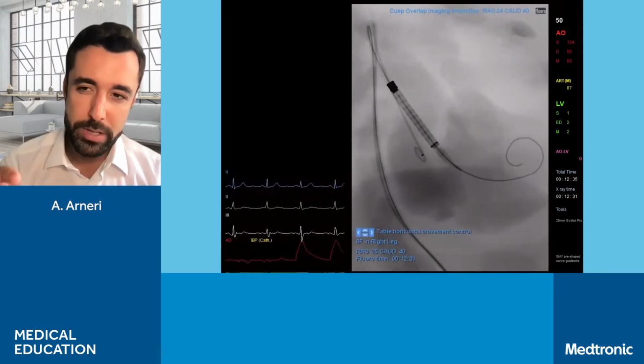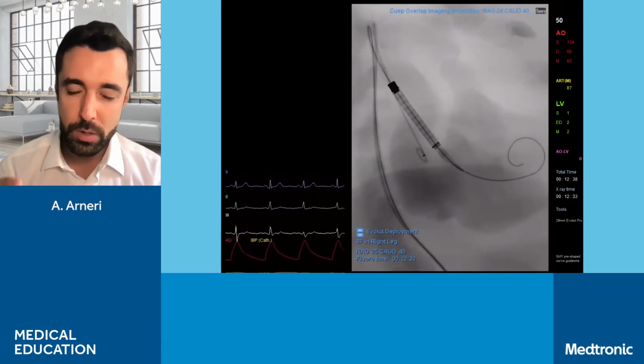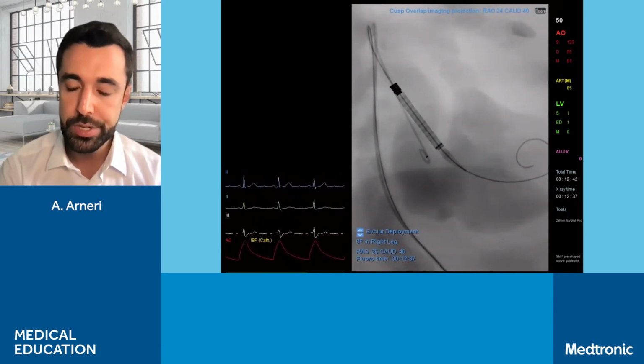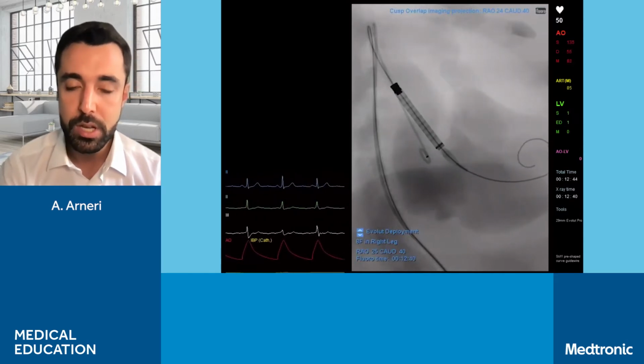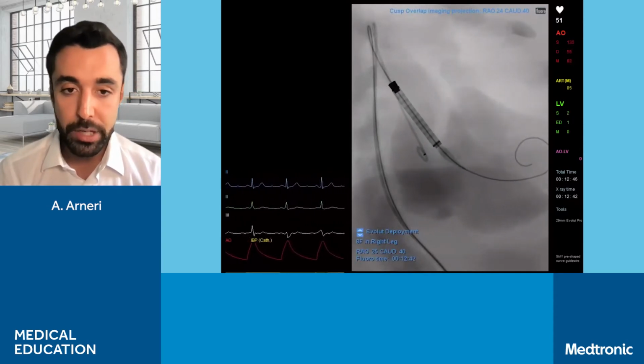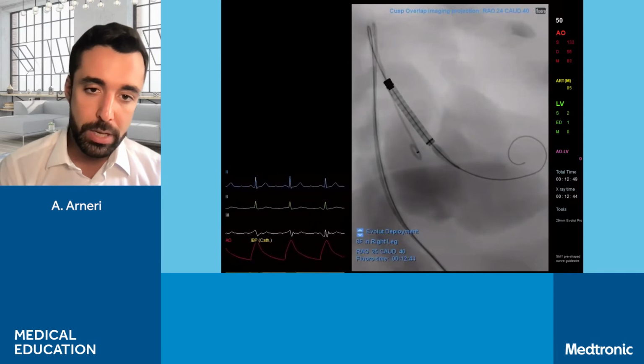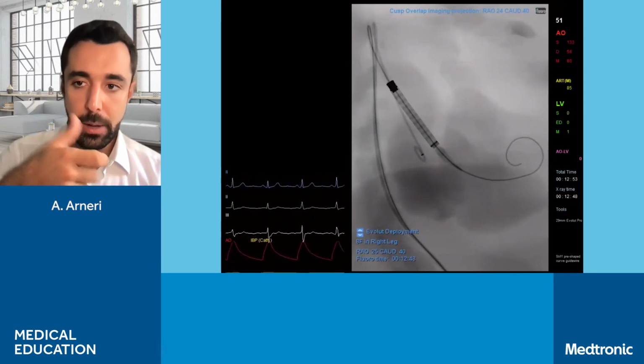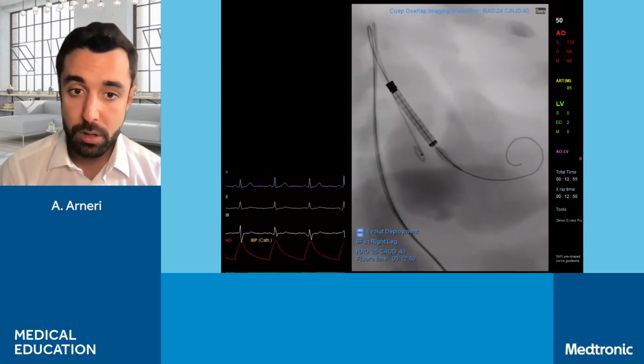So now you see we are starting above the annulus, not into the ventricle, which reduces the scratch of the nose cone of the capsule over the conduction system. This technique really reduces the risk of pacemaker implantation. And we can start now really slow to release our valve. So we start rotating the handle of our delivery system really slow.